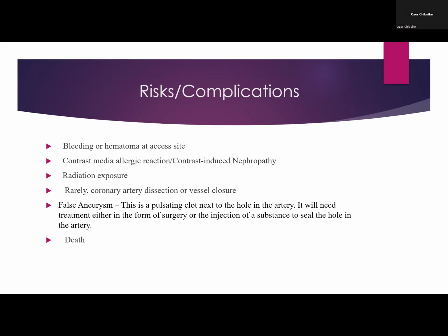And then if you want to do a carbon dioxide angiography, or if you want to use it in catheterization, you also have to adopt the use of capnography, which helps us to monitor both the ventilatory and the intravascular carbon dioxide retention, so that it minimizes the chances of toxicity. Then rarely you also have radiation exposure from the procedures surrounding the cath lab and all that. Then you also have rarely coronary artery dissection or vessel closure.